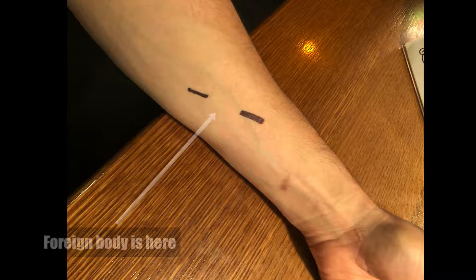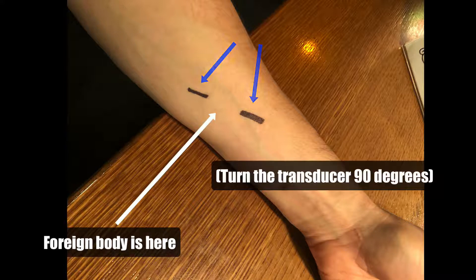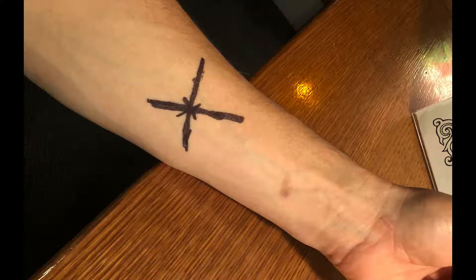What I do is I'll find it in one axis, make sure to center it on the screen, and then make two little skin marks right there and right there. Then I'll turn it about 90 degrees and make another two marks once I know that it's centered right there and right there. Then I've got these four points and I basically make them come together in the middle and I know that right at that spot is my foreign body.